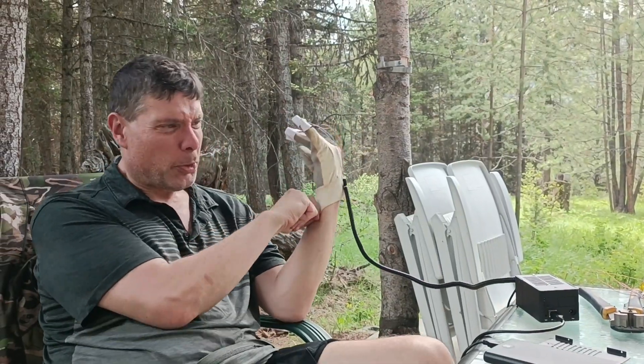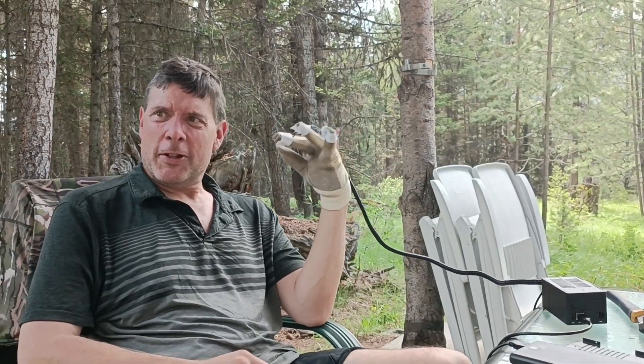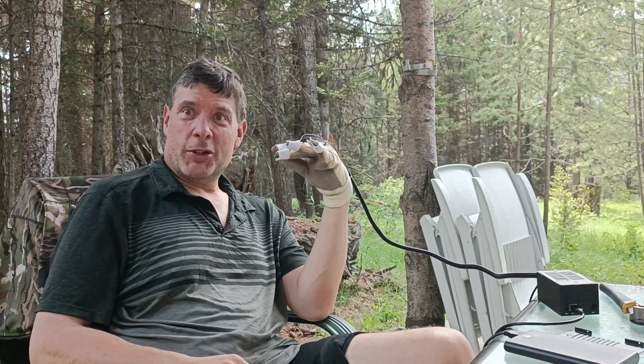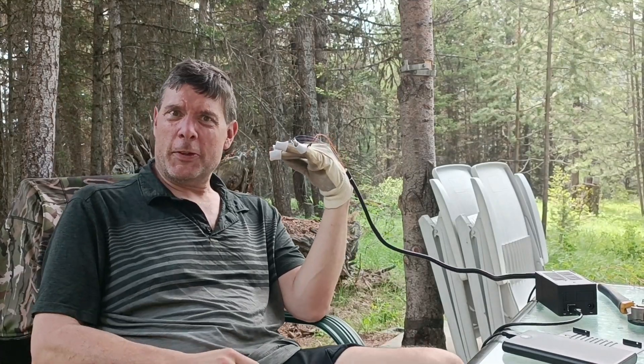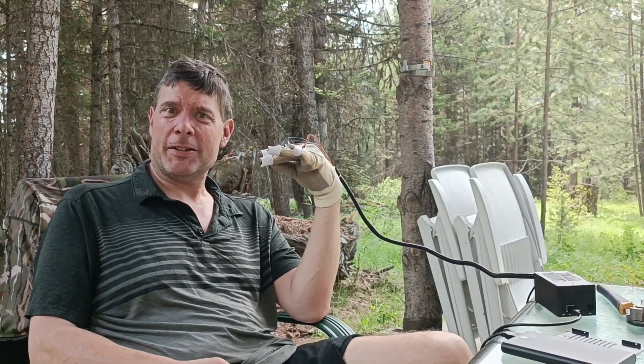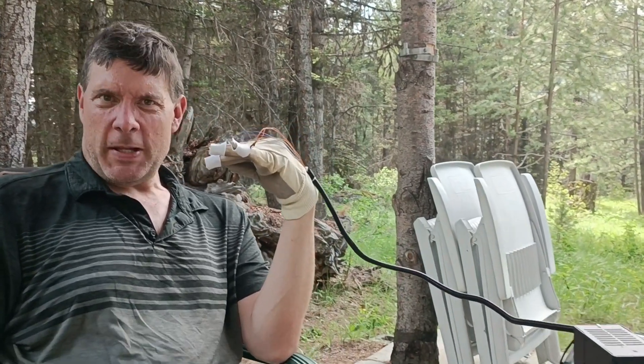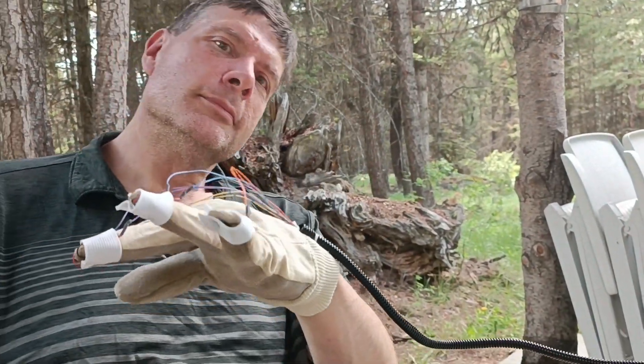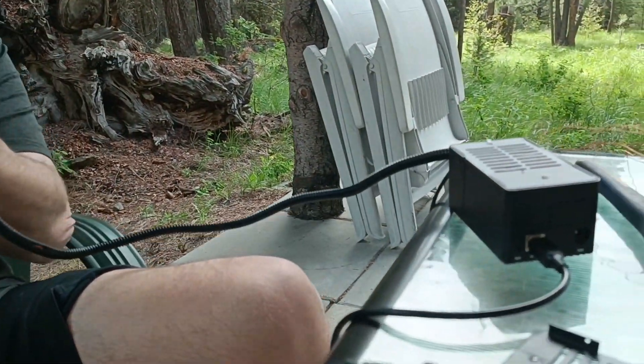We've got one glove working and the vibration pattern is good. Hopefully this makes me feel better and we can help everybody else. We'll check back when we have both gloves working. This is within 10 minutes of using one glove — my dyskinesia has already slowed down. That's just incredible.